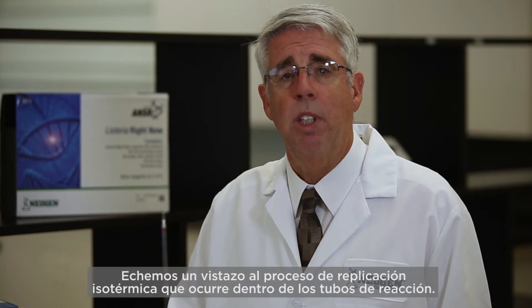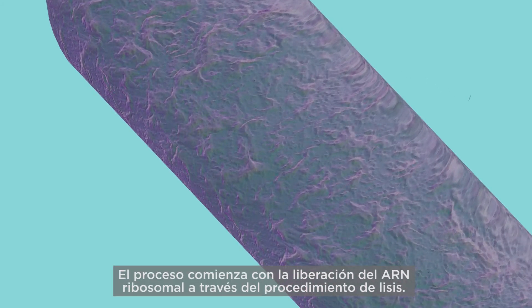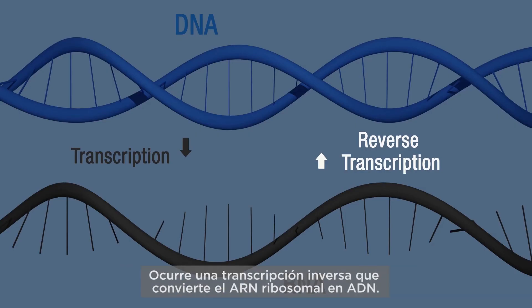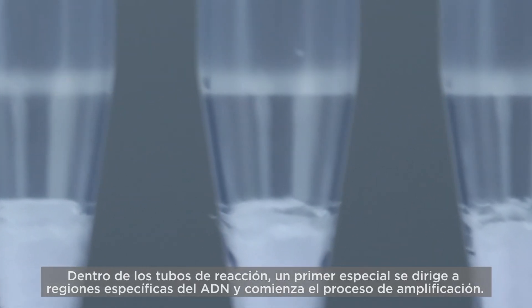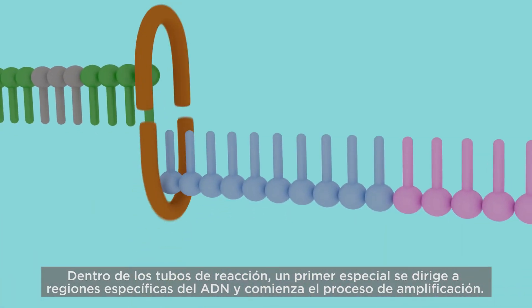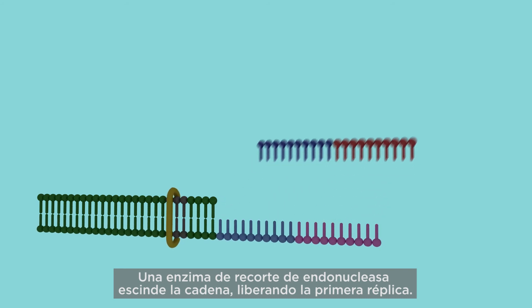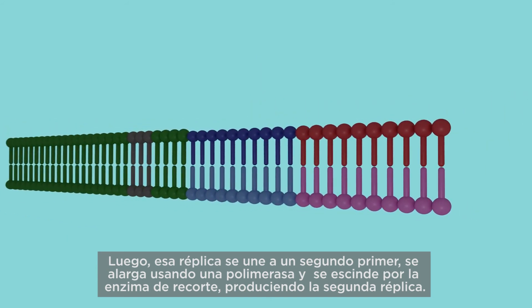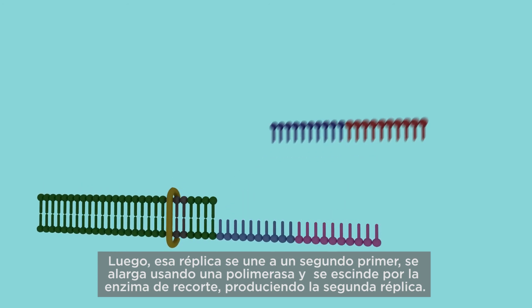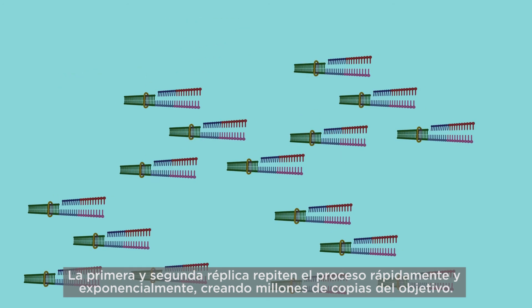The isothermal replication process begins with the release of ribosomal RNA through the lysis procedure. A reverse transcription reaction occurs converting ribosomal RNA into DNA. Within the reaction tubes, a special primer targets specific regions of the DNA and starts the amplification process. An endonuclease nicking enzyme cleaves the strand releasing the first replicate. That replicate is then bound by a second primer, elongated using a polymerase, and then cleaved by the nicking enzyme producing replicate 2. Replicates 1 and 2 repeat the process rapidly and exponentially, creating millions of copies of the target.